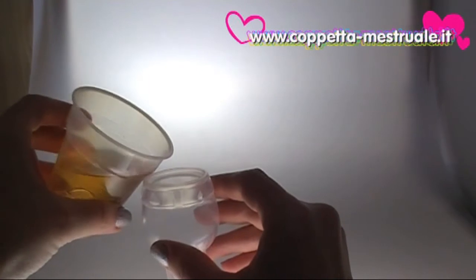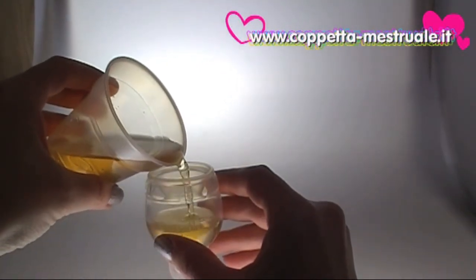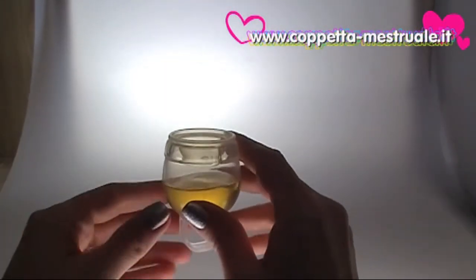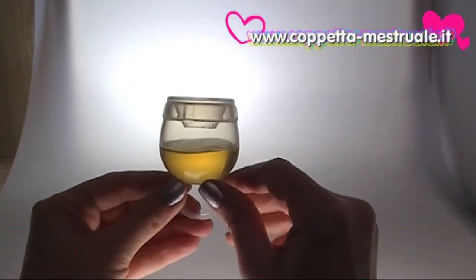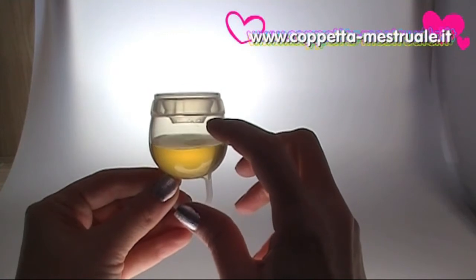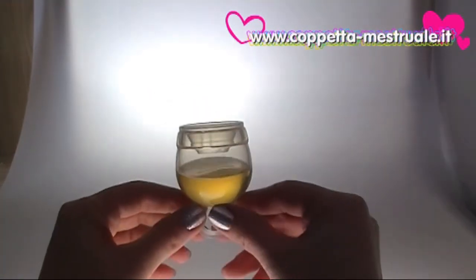So let's see how the lid works. I'm filling it more than halfway with tea, to about 20 milliliters. The full capacity of this cup up to the lid is around 34 milliliters, demonstrating the large collection capacity of the Femicycle.